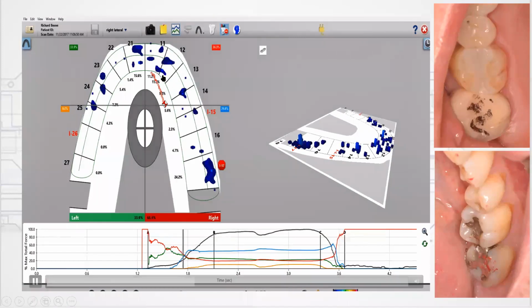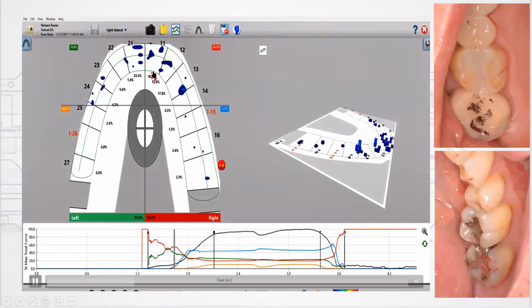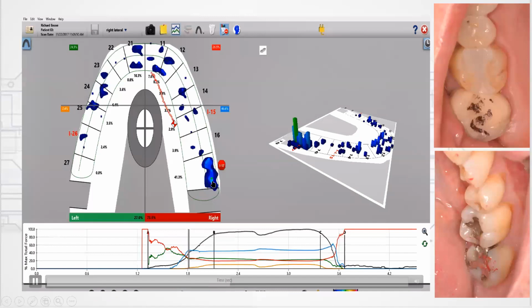So the center of force, which again moves towards high forces, you see it goes right towards the 1.7 implant. And there's extreme overload there. There's not only one high force, there's also a collected area of moderate force. And this is the nature of the implants. The rigidity concentrates stress. There's a physical principle known as the least mobile element. The least mobile element in any system concentrates all the stress. And so, implants concentrate stress. The other 2 implants were managed reasonably. They have low forces on them. But you can see the center of force travels right to where the stress is being concentrated.